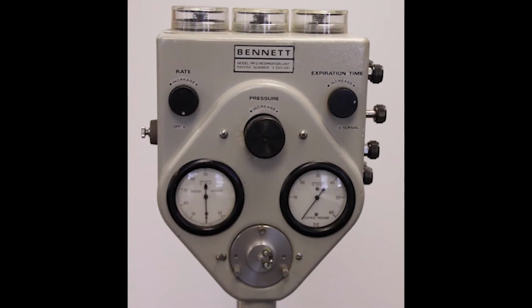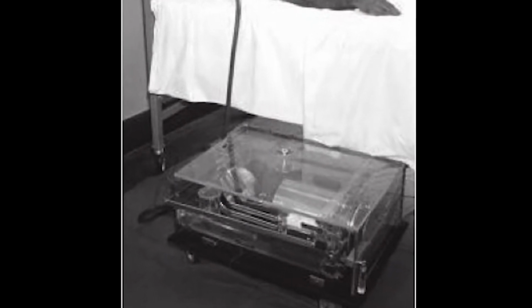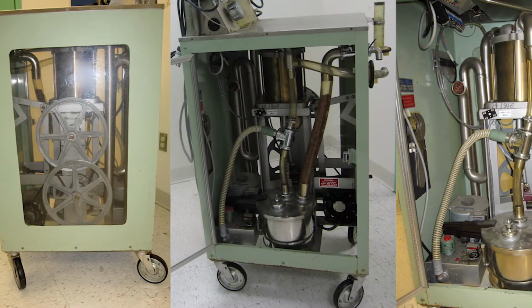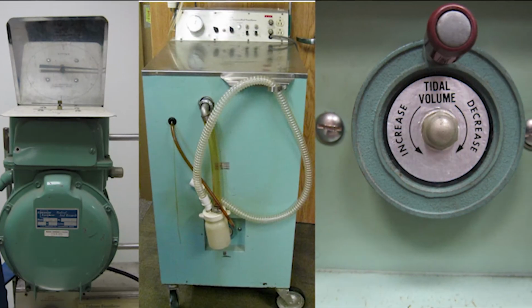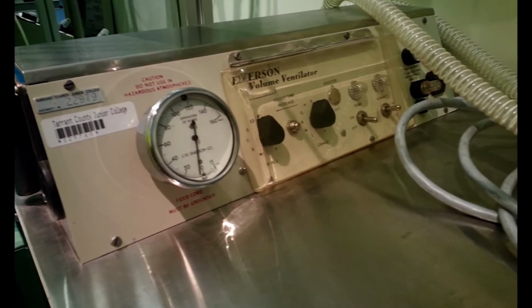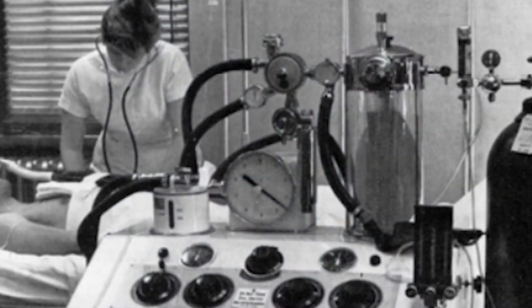In 1954, the Merck respirator contained a single limb circuit, was driven by a piston, and was designed to fit under the patient's bed. There were no specific settings to ventilate the patient at, and gas was delivered at a set I:E of 1 to 2. A few years later, the Emerson 3PV came into circulation. It had the ability to monitor some pressures and volumes and an adjustable I to E. Other first-generation ventilators include the Draeger Spiramat and the Engström respirator.